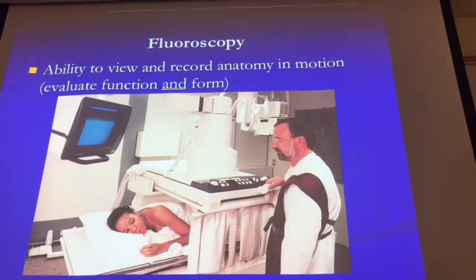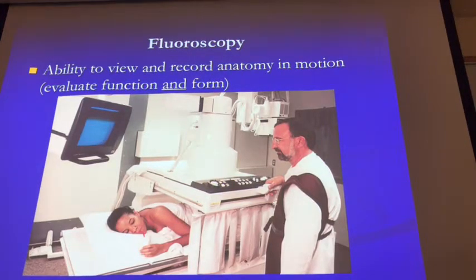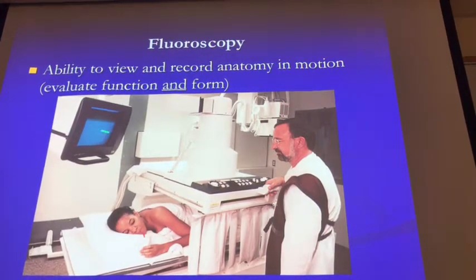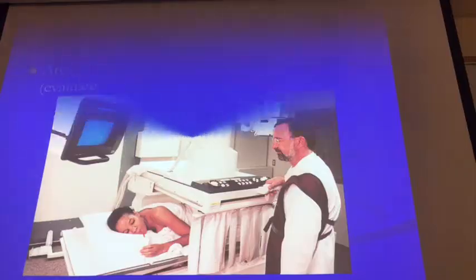All right, just briefly, what we have here: you have a patient drinking the contrast media. This is your image intensifier, and these are the controls of the image intensifier. You have some kind of monitor display where the radiologist can see what's going on. Since it's live x-ray, the doctor can see, and you can see, as the patient is swallowing, as the patient is moving, or as the digestive tract is moving.